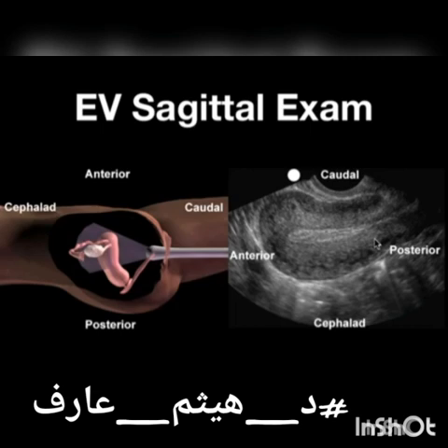I always recommend, regardless of how early you think the patient is, start off with the transabdominal exam. Since you're using a lower frequency transducer, you're going to get a broader view of the pelvic anatomy. It's possible with this high frequency coned in image here that you could miss pathology. So remember, don't use the one exam in exclusion of the other. Start with the transabdominal exam. If that gives you your answer, you can stop at that point. If you don't have your answer, then move on to the endovaginal exam.